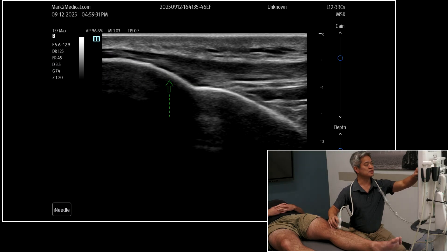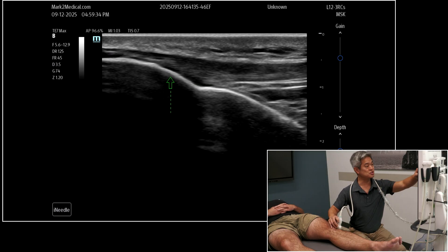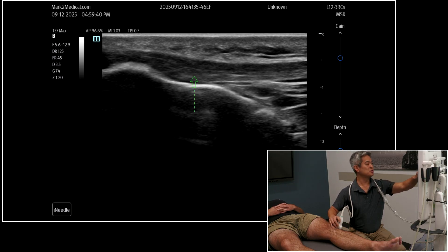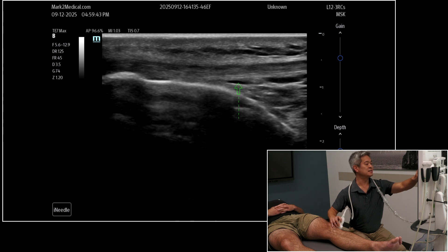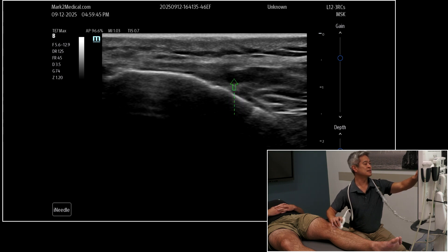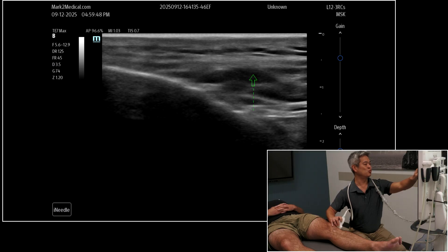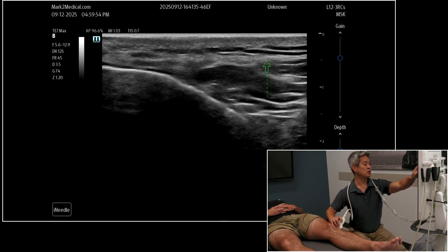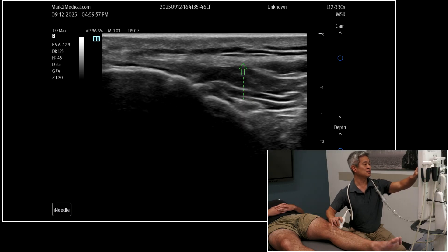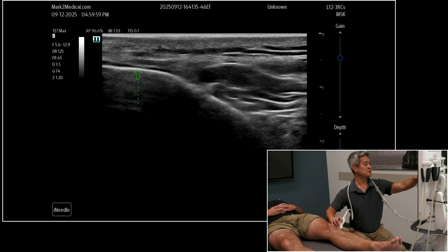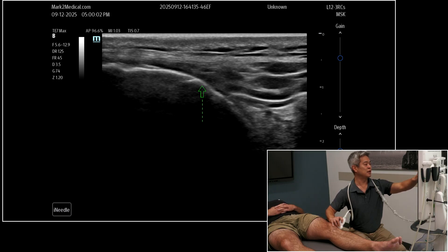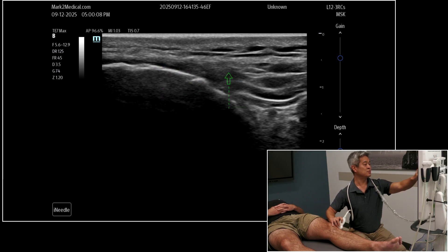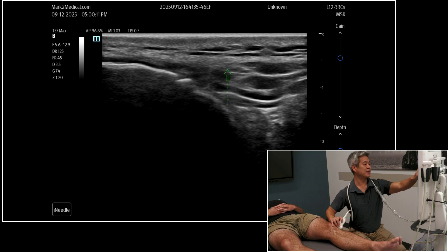If I'm going to visualize the lateral retinaculum, you can see that my hand is going to start sliding laterally. What happens is the tibial tuberosity disappears, and the patellar tendon disappears, and instead you get this wispy-looking hyperechoic structure that has more or less a linear appearance but with a little more laxity to it. This is the lateral patellar retinaculum. Many times in symptomatic individuals, as you can see in our subject here, they will have some cortical irregularity and hypoechoic signal here indicating potential strain of that lateral patellar retinaculum.